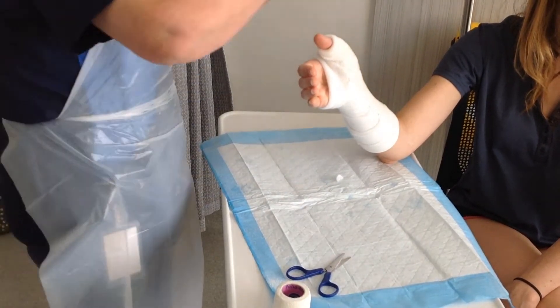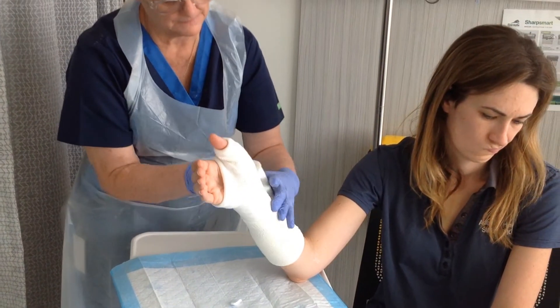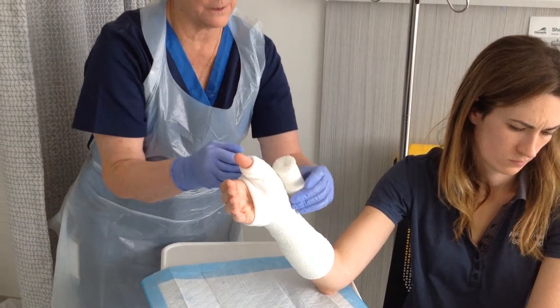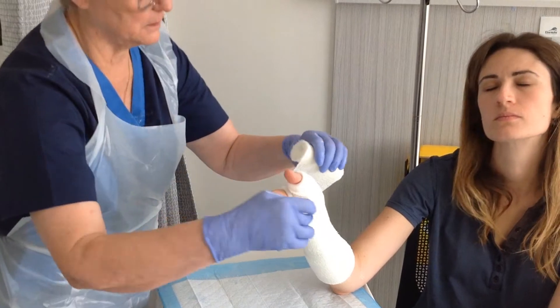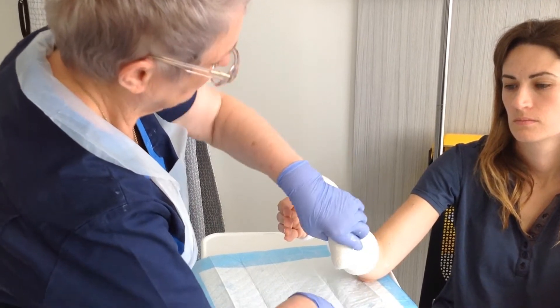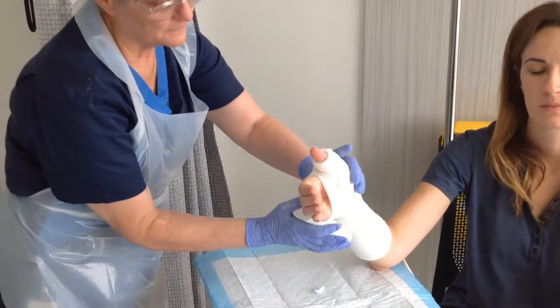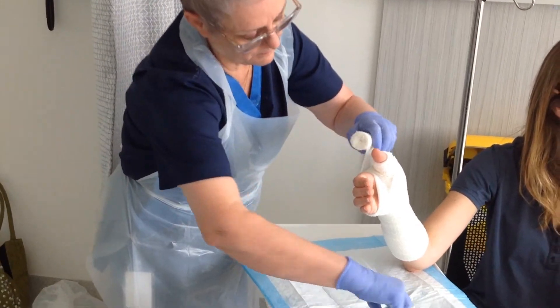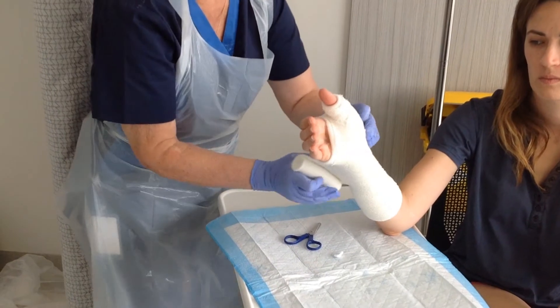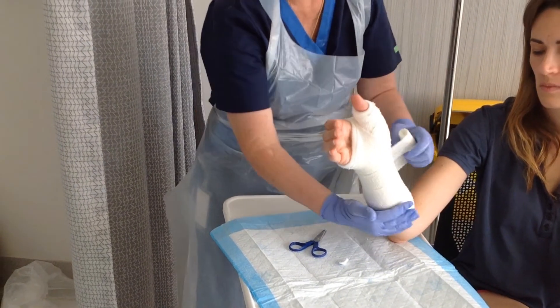We then take our bandage and start at the bottom, coming round with fairly good tension — we don't want the back slab to fall off; it needs to support the fracture. Keep your fingers out of the casting material. As we come round to the thumb, because of the size of bandage, we make a little cut and bring that around, collect it up through the back, another little cut on the angle, bring that round, then go back down again. That gives us at least two bandages supporting the splint.